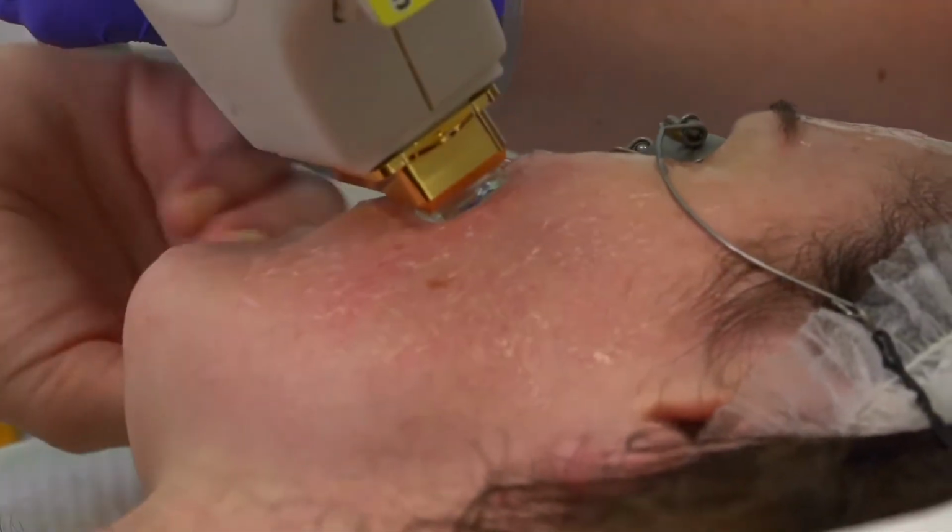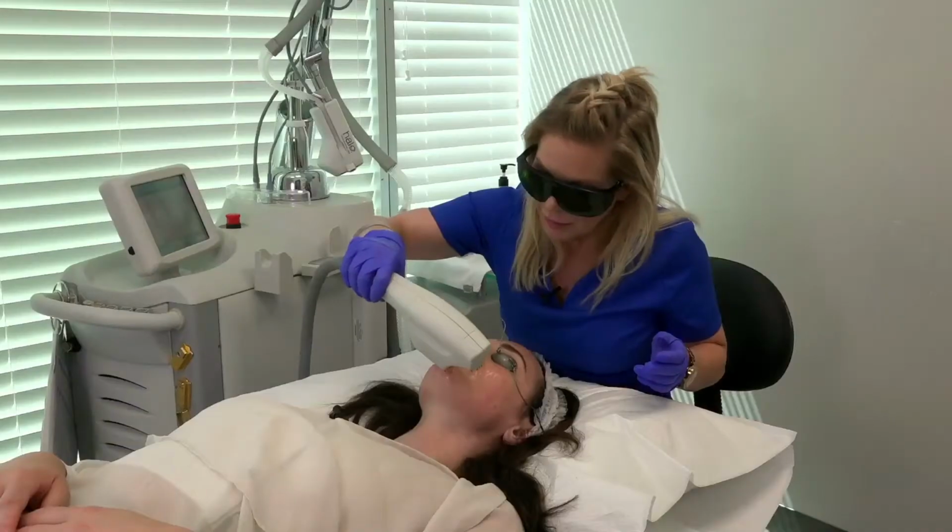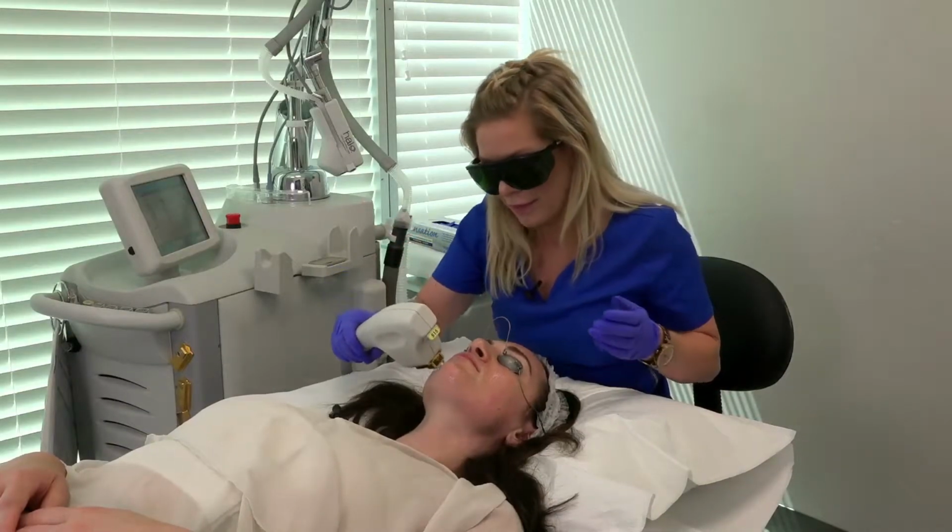So I think it's important to examine someone's skin and take their history, making sure that they haven't been exposed to sun or that they're not using medications that sensitize their skin. There are some antibiotics that do that. So I think it's important to get a thorough history and to examine someone's skin, figure out really what skin type they have before determining whether someone is a candidate. It's not just having something that can be treated with BBL, it's also, can you treat that problem in that particular person if they're on medications, if they've been out in the sun, etc.